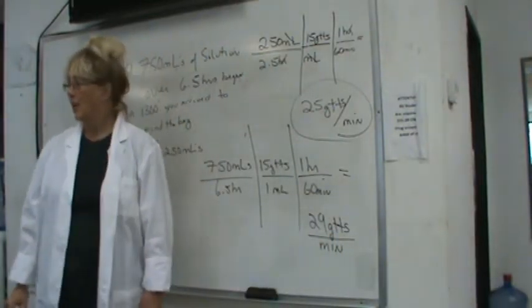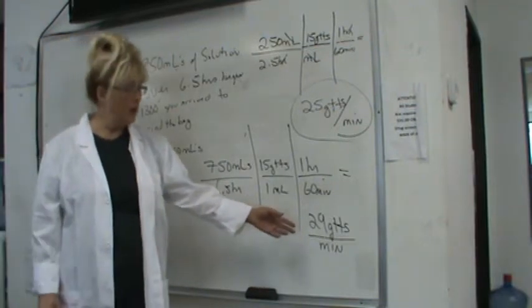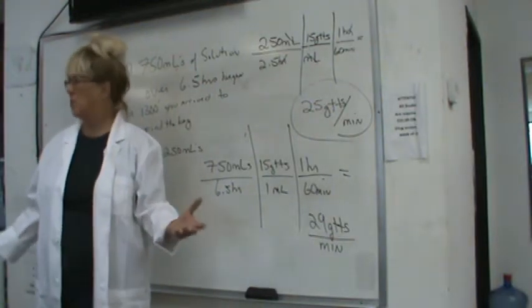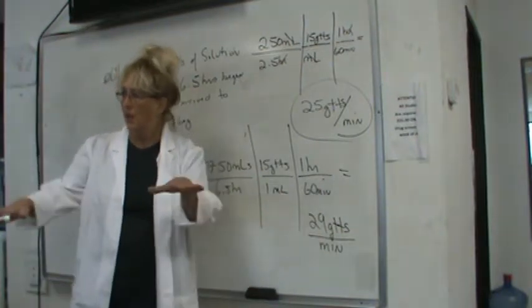Yeah, I'm 4 drops short, so I have to adjust. Basically they were going a little too fast, weren't they? We had to slow it down, but not too much. We didn't have to slow it down by too much. They were pretty much in the range.